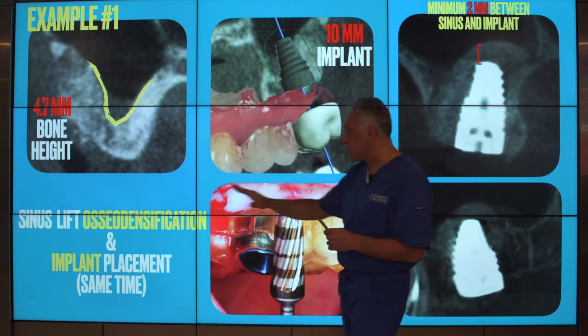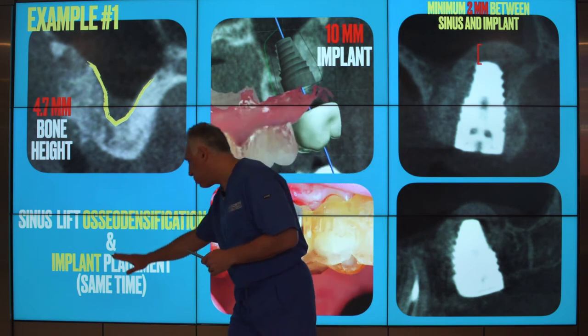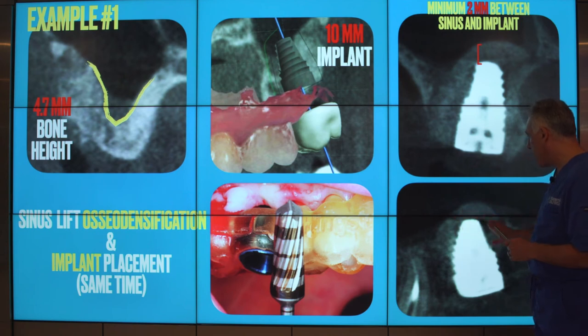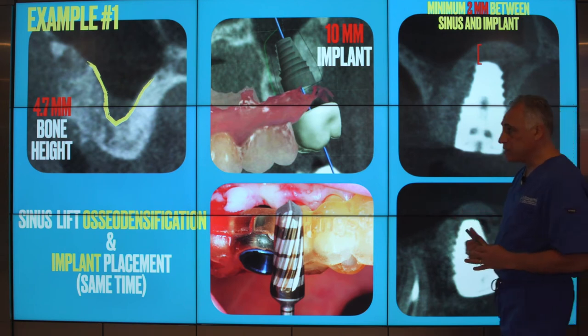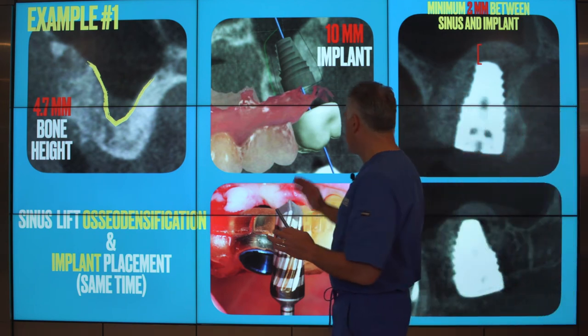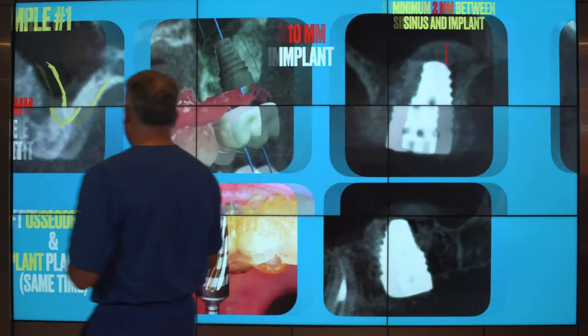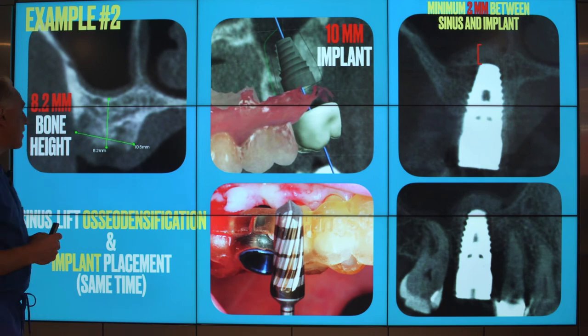So this was done using the sinus lift osteodensification, placement of the implant at the same time, and here is the outcome afterward. This was done through the access where the implant was done, and the outcome was quite satisfactory.